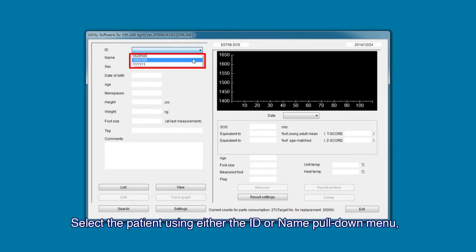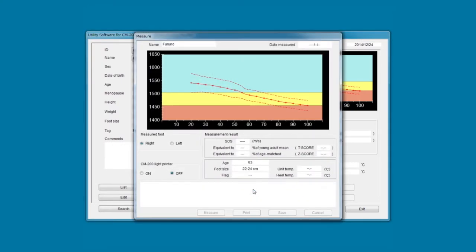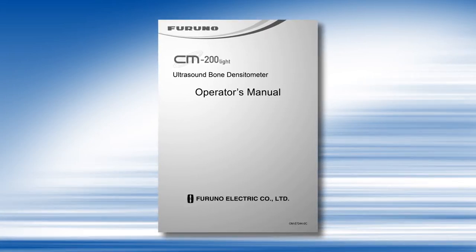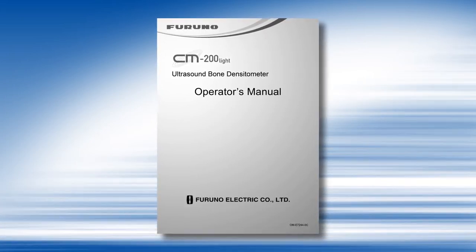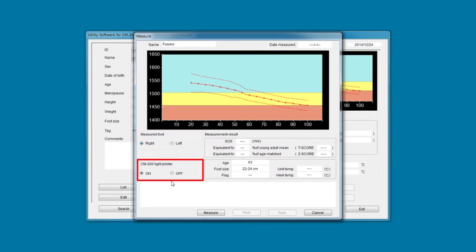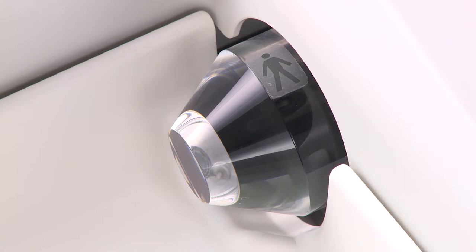Select the patient using either the ID or name pull-down menu, then click the Measure button to display the measure screen. For information regarding a new data entry, please refer to the operator's manual. Select the foot to be measured by placing a check mark in right or left. Select whether or not to print with the CM200 Lite printer by placing a check mark in on or off. This completes the pre-measurement data input.